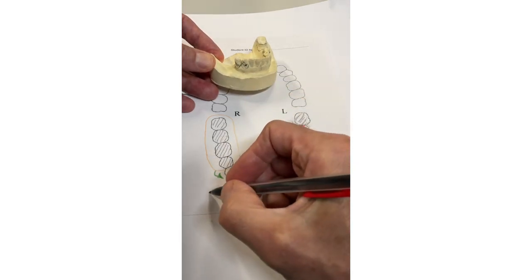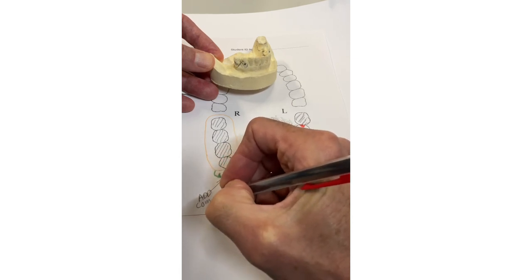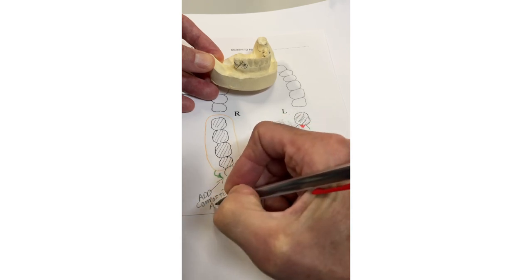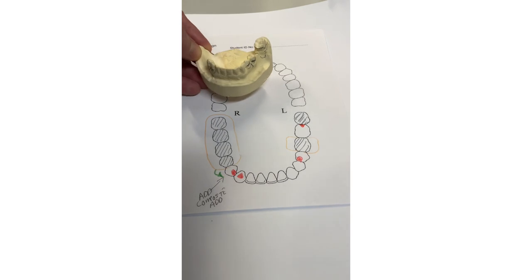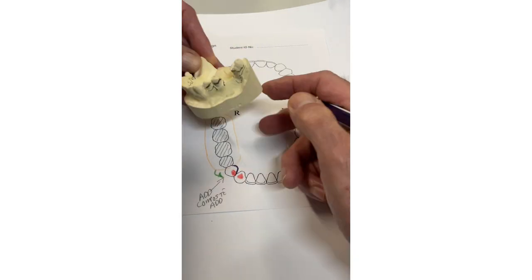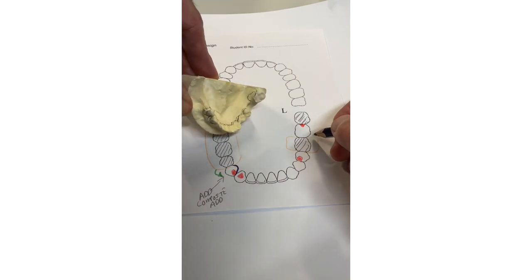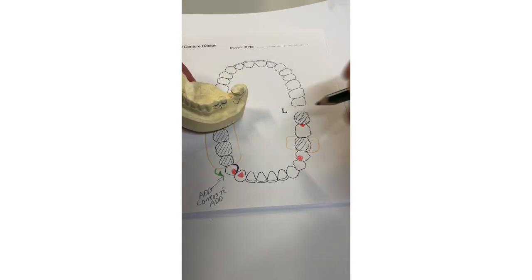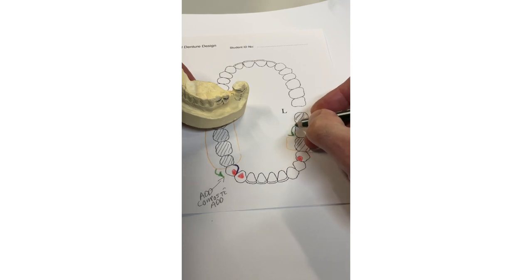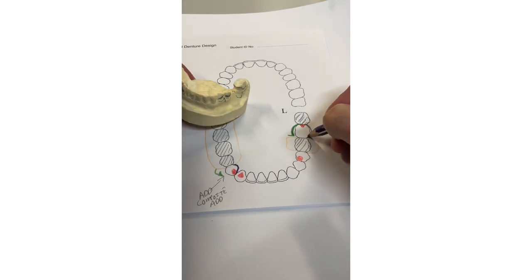To retain the lower right free-end saddle: the undercut is too low so we're going to place a gingivally approaching clasp, but we'll have to raise the undercut — we'll ask for composite to be added to create an undercut. The tooth on the other side looks fine. As soon as you clasp the tooth you have to reciprocate, so bring denture base around — short clinical crown might end up being lingual plate. On the other side, the best undercut on lower molars is usually mesiolingual, so engage that undercut. A half arrowhead shows the lab where you want the retentive tip. Add buccal bracing to reciprocate the action of the clasp.